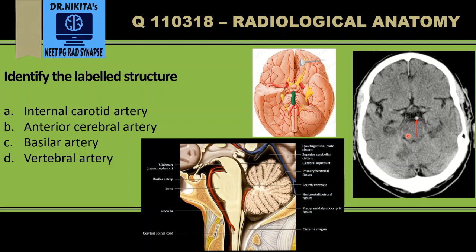This is the pons on the CT scan, and in front of it is the basilar artery — that is why the answer is basilar. Also, if we look at this image, this is the terminal part of the internal carotid artery, which divides into the middle cerebral artery and the anterior cerebral artery.